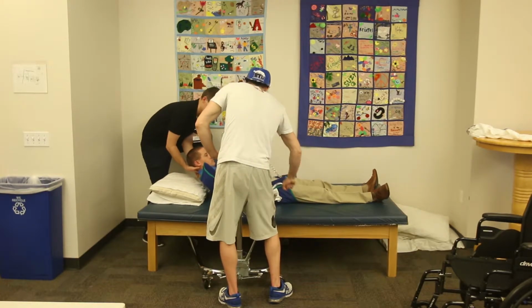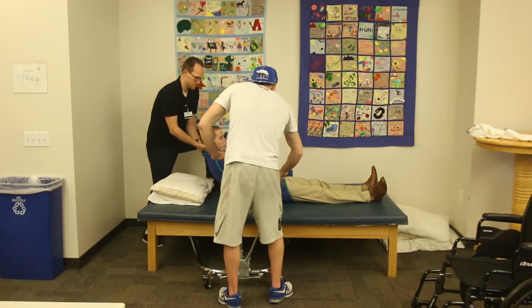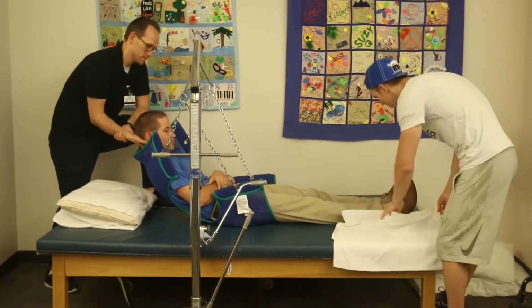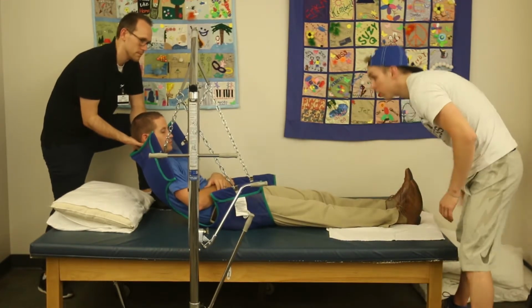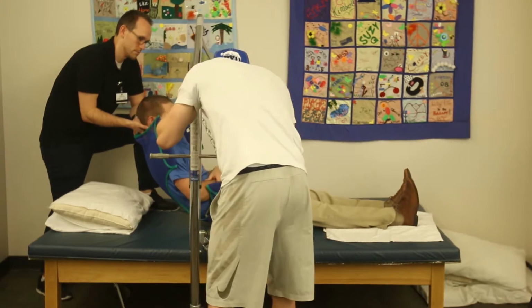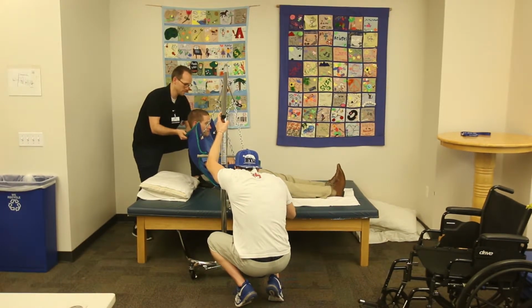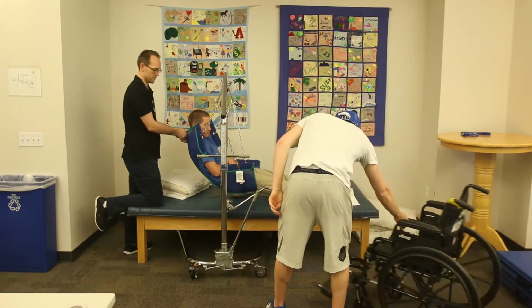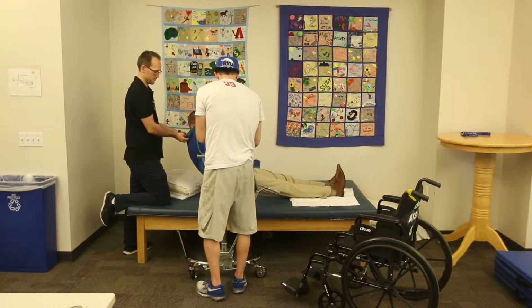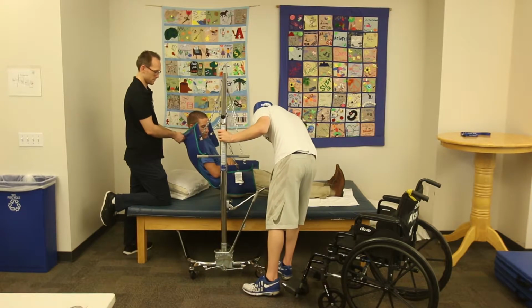Good. Okay, now the point where the feet are going to start coming off, we're going to put a towel just right underneath that so we don't cause any problems with those dragging. Okay. Now we are going to make sure that the wheelchair is locked into place. That way, when we get you set in it, there won't be any problems. We'll unlock this. Now we're going to come out nice and slow.